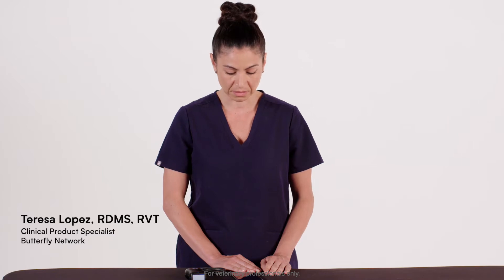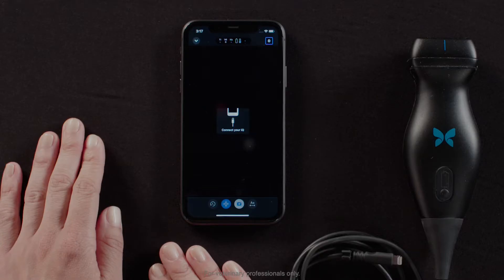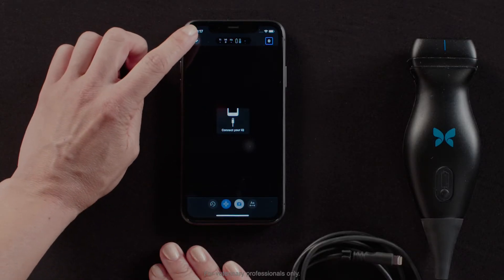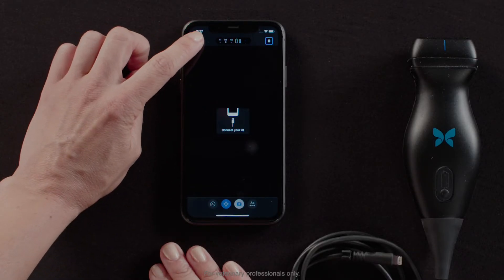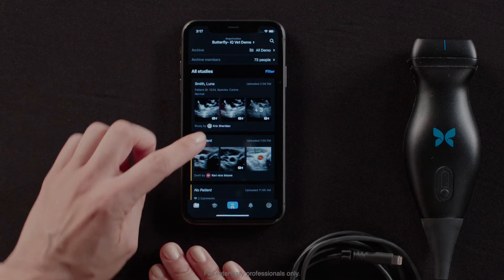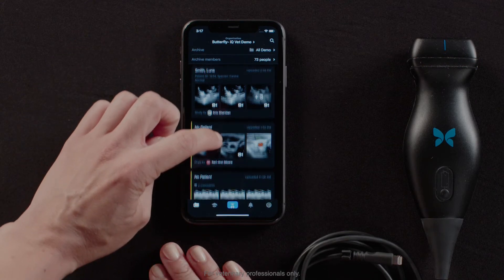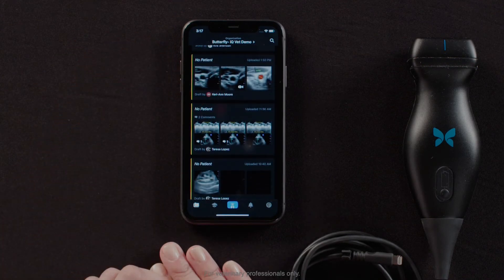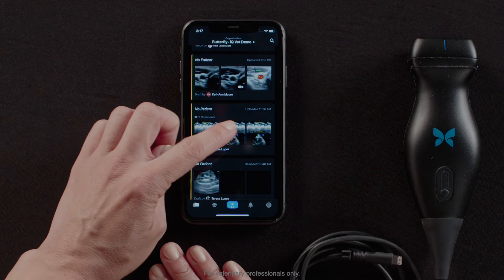With the Butterfly, there's no need to go to a separate workstation to review your images or studies. On your mobile device, you will tap the down arrow in the top left hand corner, and I can scroll through the studies that have been uploaded into the cloud.